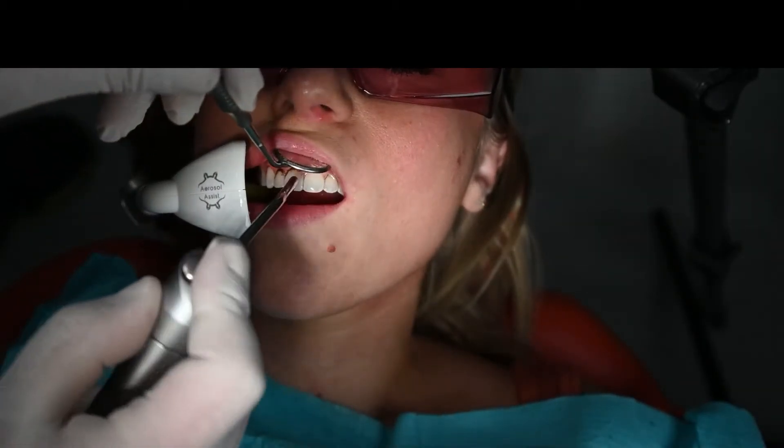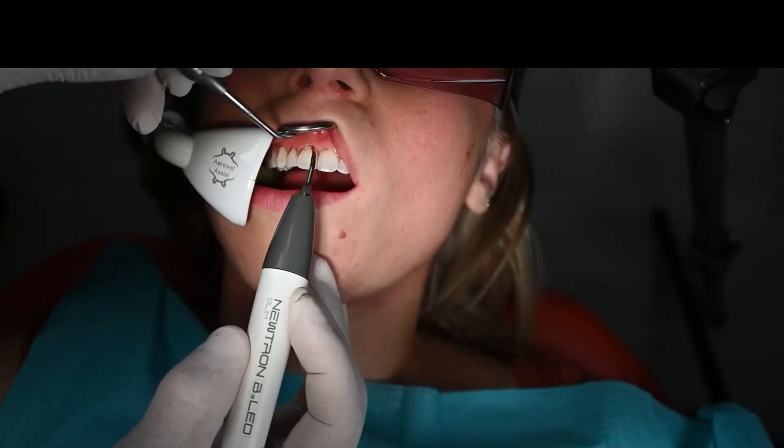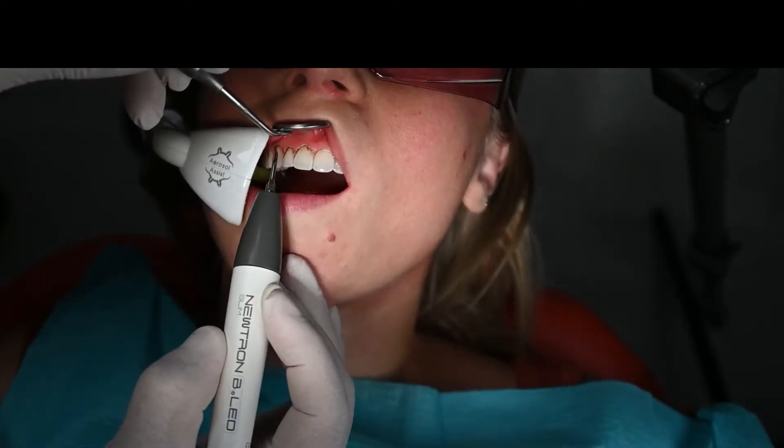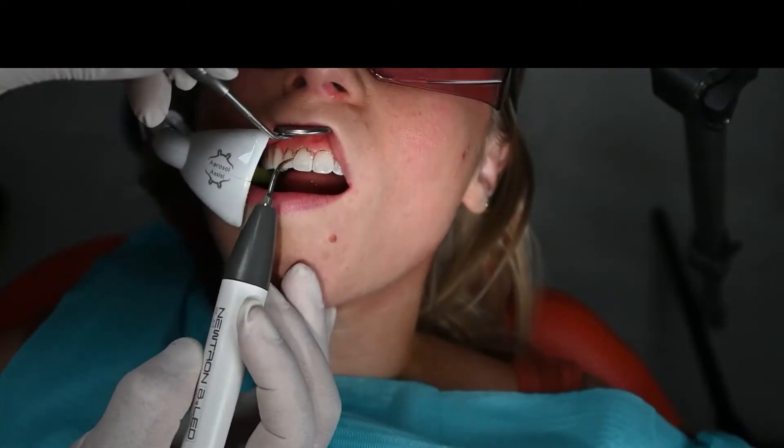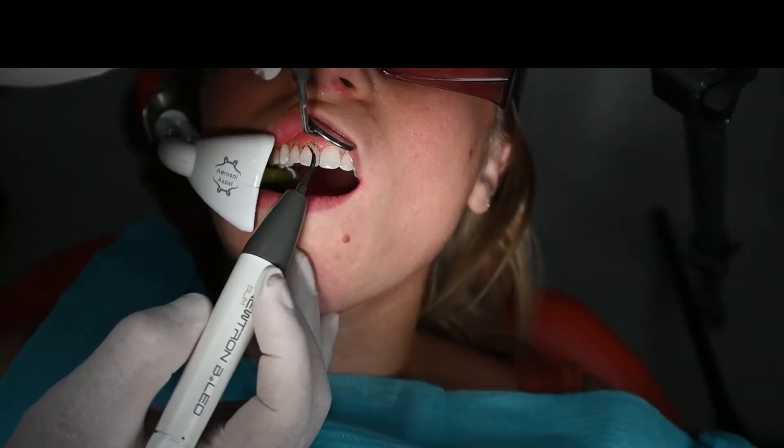Air, water, and the piezoscaler are used to remove ablated tissue and to verify the correct architecture is achieved. This is a very important step before finishing the procedure, as ablated tissue might give the incorrect perception and therefore lead to less than optimal results.